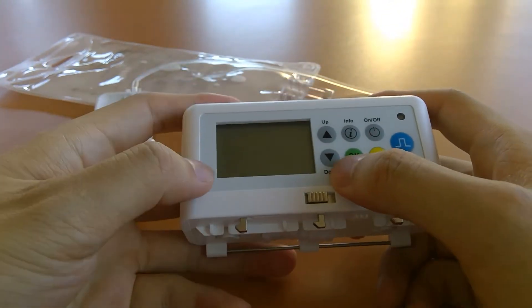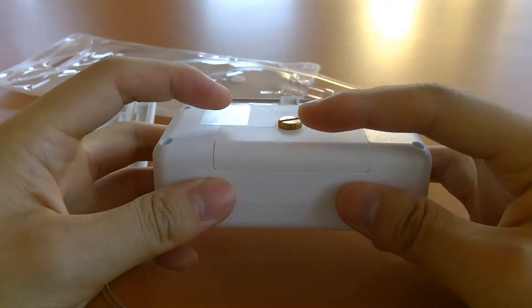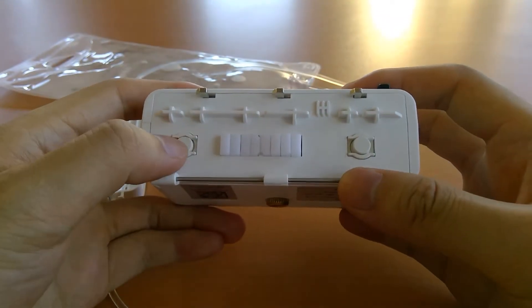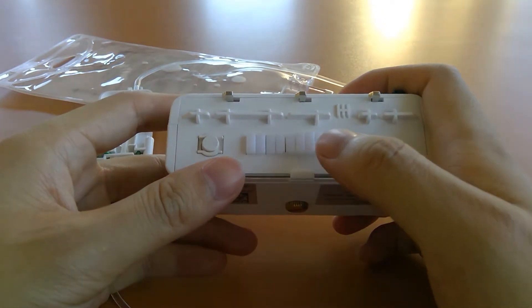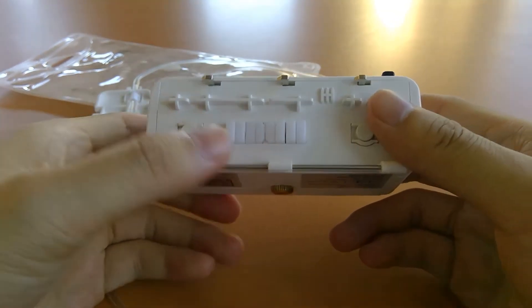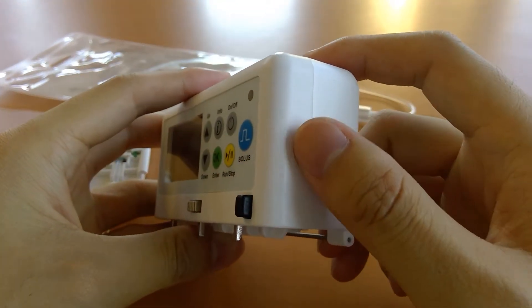You have your LCD screen, no backlight, an LED up here, and a membrane keypad. On the back there's the battery compartment. On the bottom you have downstream and upstream occlusion sensors, and your linear peristaltic pumping mechanism. This pump is single channel only, but we do have a mount where you can stack multiple pumps together. On the side you have a micro USB port.